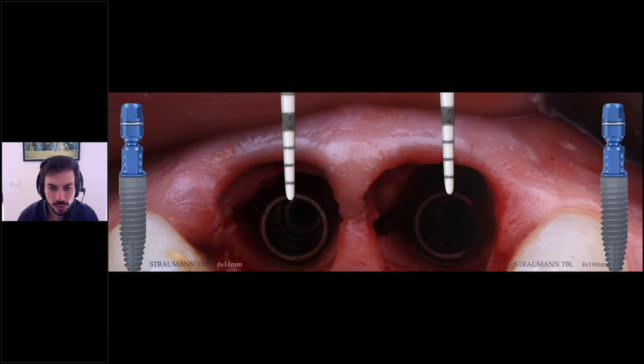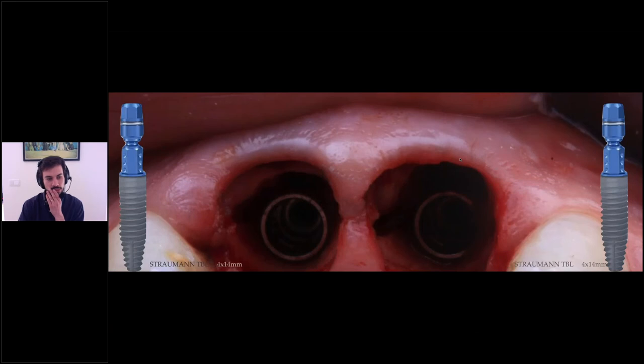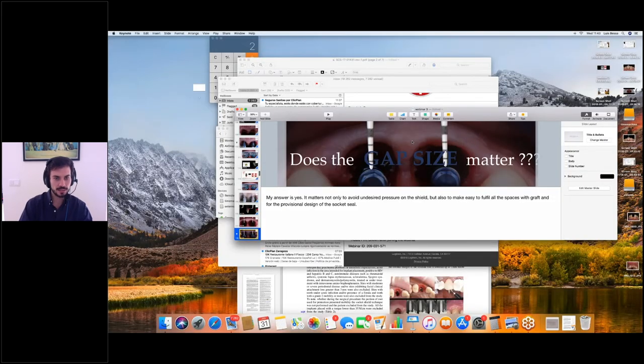So we should measure our gap after we put the implants, and after we put our implants, we should go for the prosthetic restorations. I'm sorry, some problems with the presentation. Okay. And does the size of the gap matter? Okay.